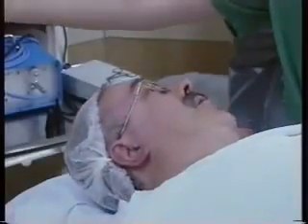The operation is fast and painless. A 2 millimeter diameter tympanostomy heals spontaneously within a month. The operation can be repeated in case of a reoccurrence of seromucous otitis.